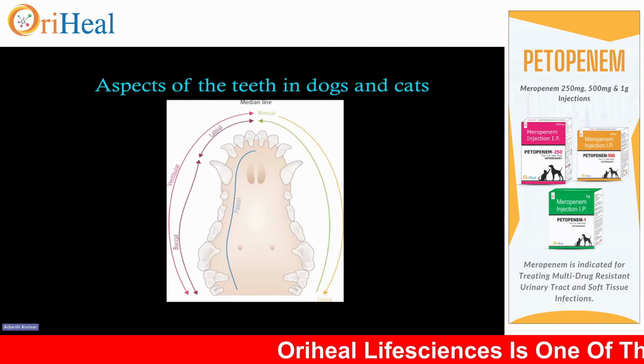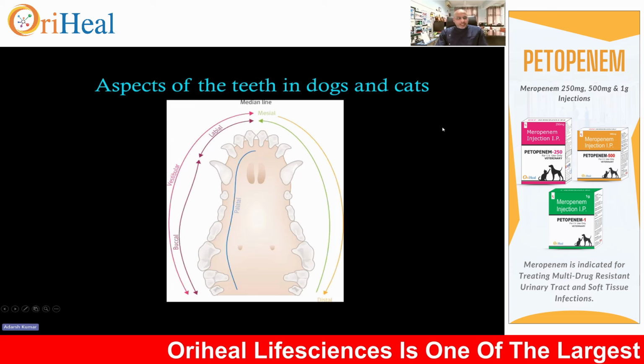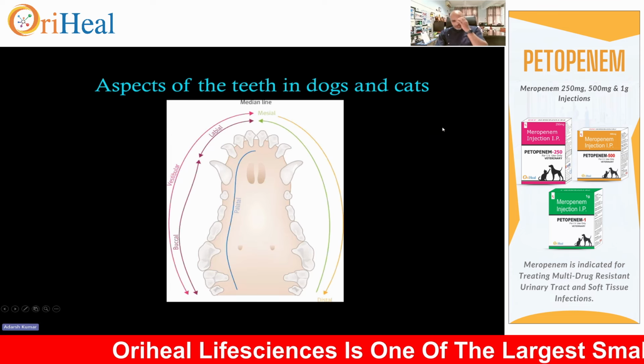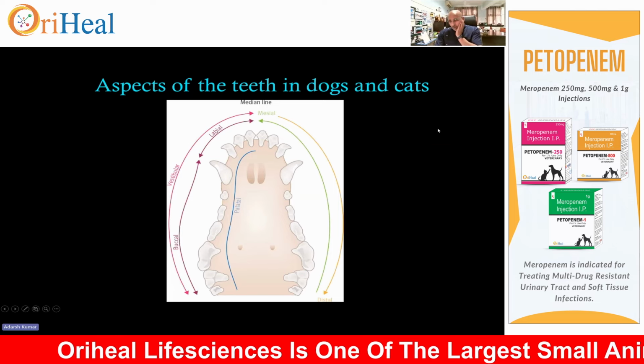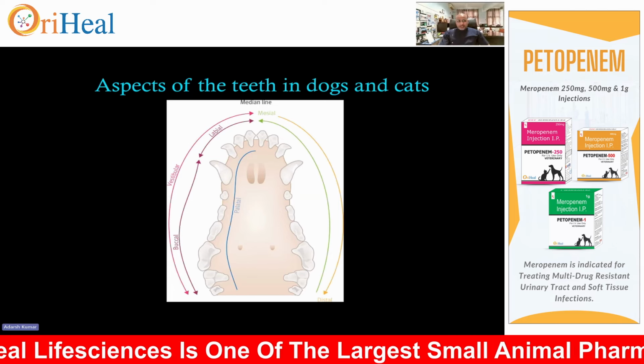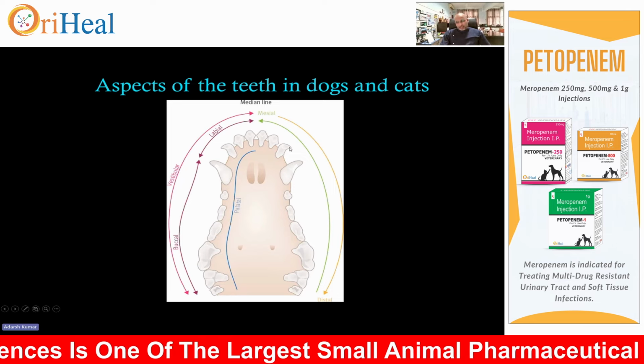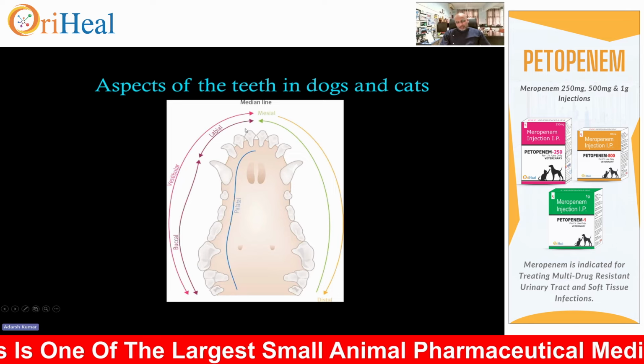Let us begin from the beginning, and this is our third in a row. And in the third, we are to discuss dental extractions. I'll start from the basics and begin from the beginning. Let's see the aspects of the teeth in dog and cat.